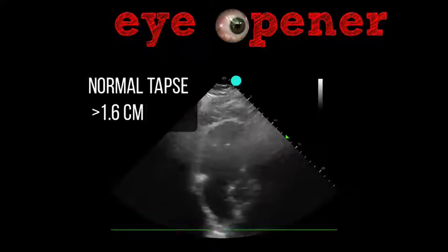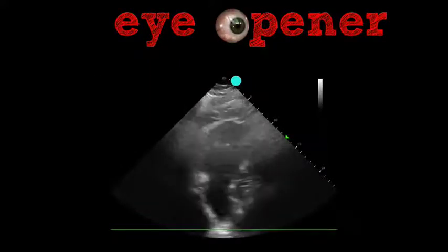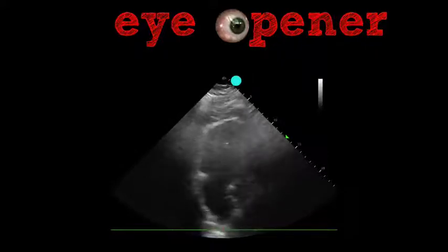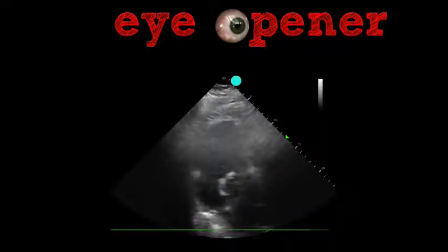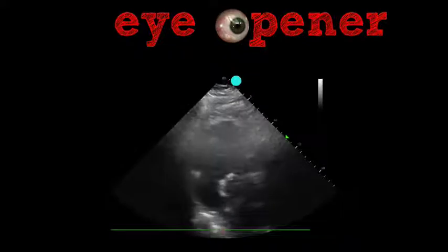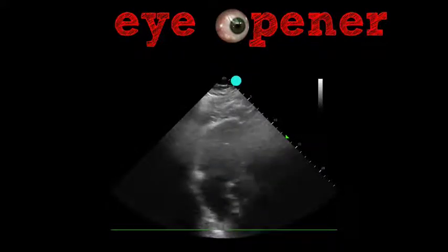If it's not squeezing well, then we won't see much distance traveled by that tricuspid annulus. And so a number less than 1.6 centimeters for TAPSE indicates an impaired systolic function of the right ventricle.